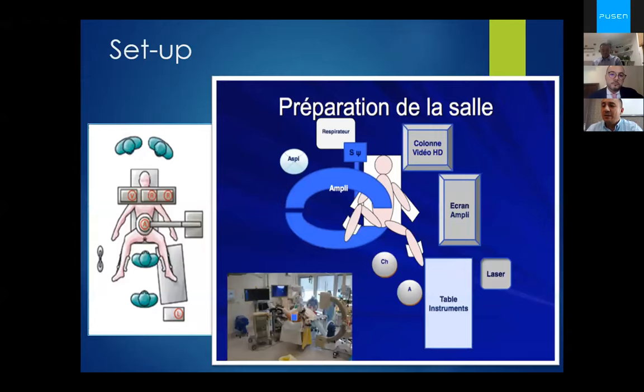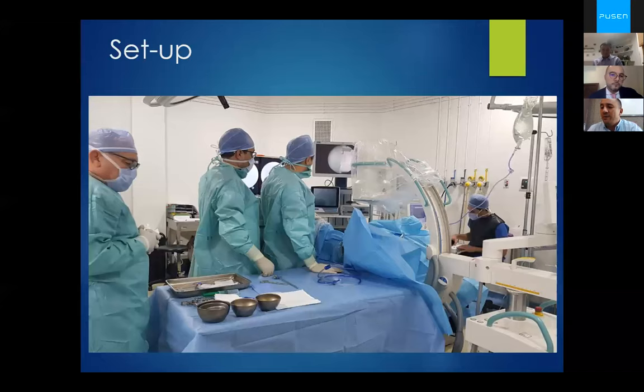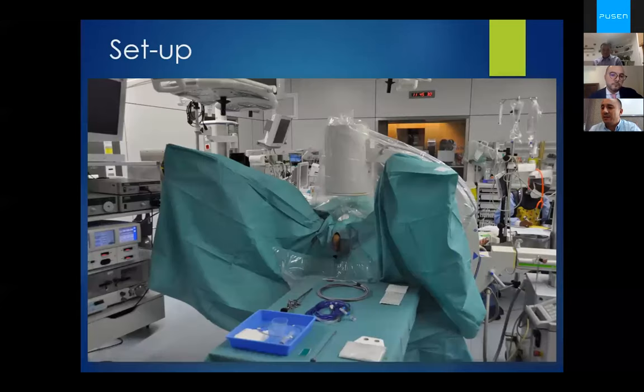As you see, the preparation of the room must be unequivocal, a routine work, nothing should be left to chance. Here in our unit, we always use this setup, whatever the site of the stone. As we see here, the table has four areas, working area, dirty area, wet area. So it must be a routine work.